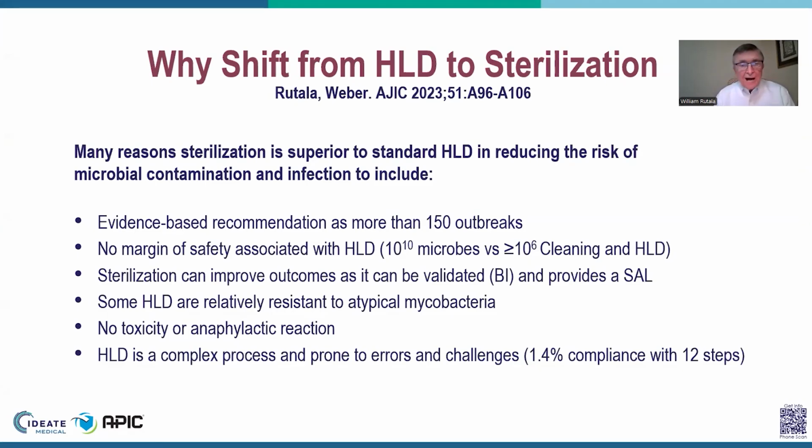Other issues include high-level disinfectants are relatively resistant to non-tuberculous mycobacteria. You may know that there's been many outbreaks associated with use of high-level disinfectants and non-tuberculosis mycobacteria. You may know that, of course, there's toxicity associated with glutaraldehyde and peracetic acid, and there's anaphylactic reactions associated with orthophthalaldehyde. And of course, we all know that high-level disinfection is a complex process and prone to errors and challenges.